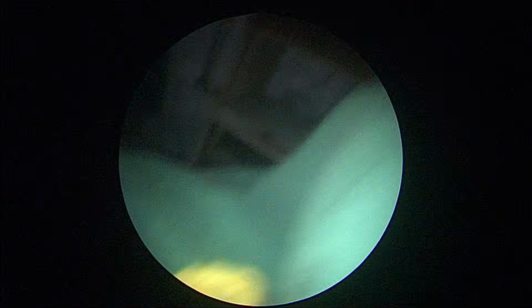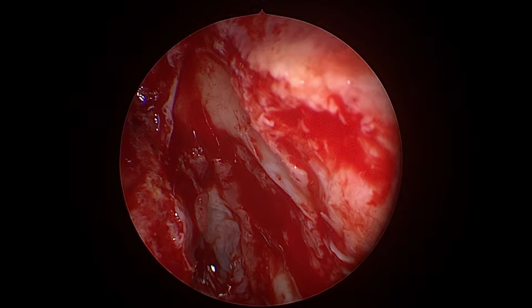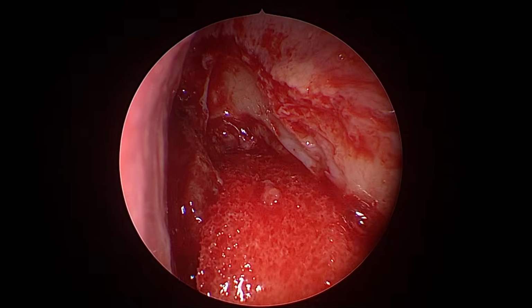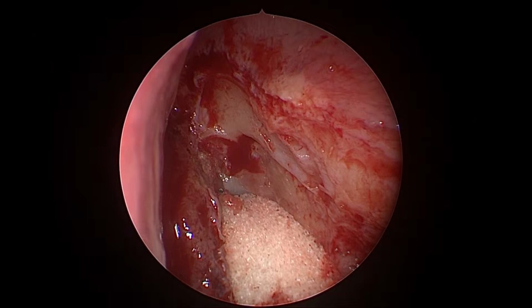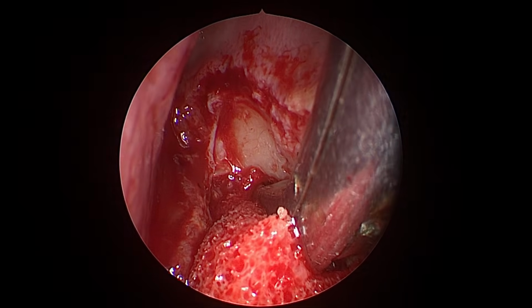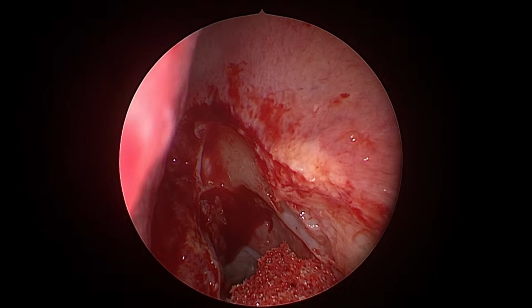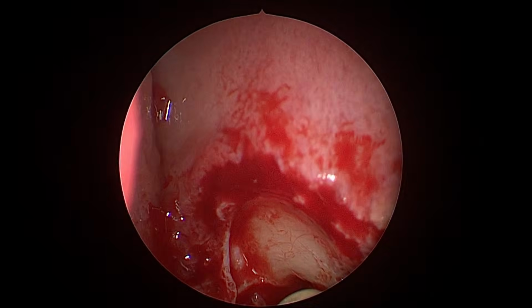Give me a thinner one. Because now with the 70 degree, under vision, I have my lamina in view. If I keep an eye on the lamina while dissecting and do not cross it laterally, my orbit remains intact. If I keep my turbinate in view and don't breach it medially, my skull base is by and large preserved. Okay? Yes, sir. And if you work in this direction, anteriorly, you are automatically away from the skull base behind. Got my point? Yes, sir.